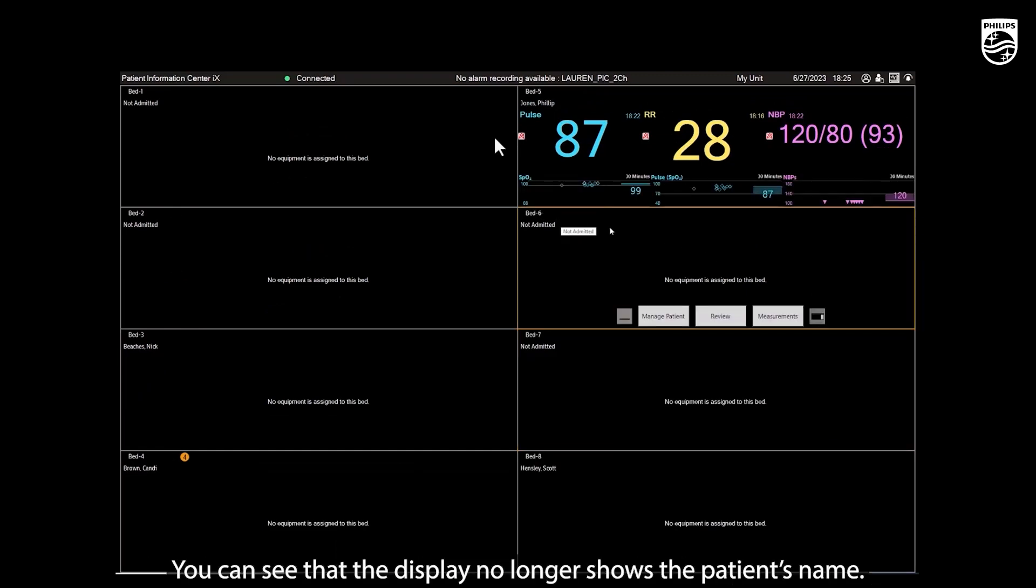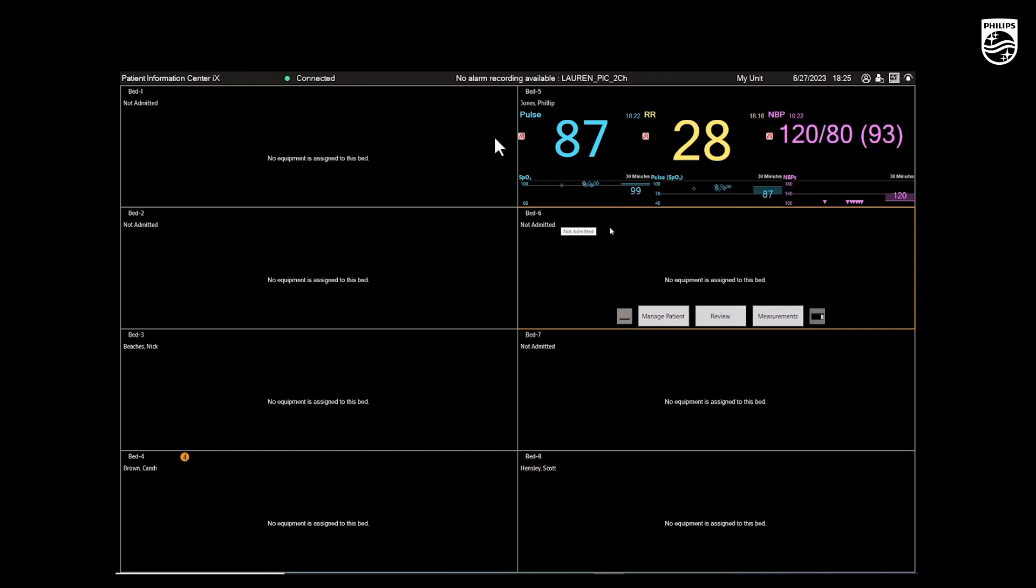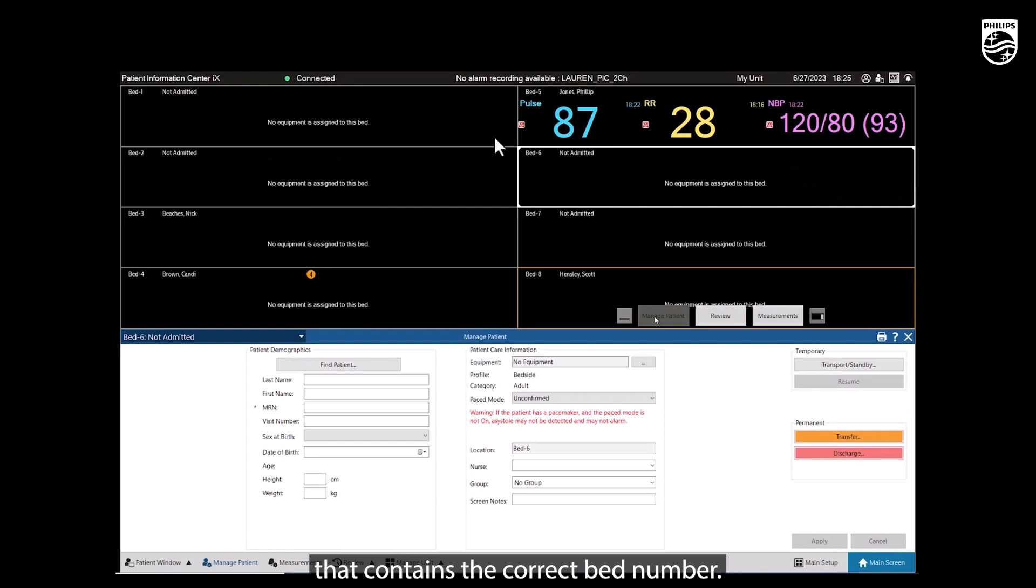You can see that the display no longer shows the patient's name. A discharged patient can be easily readmitted. To do this, select Manage Patient in the sector that contains the correct bed number.